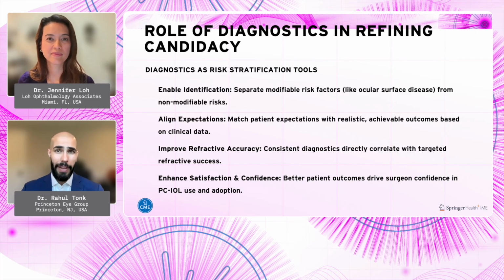And then, of course, you can get more advanced. You can do non-invasive tear breakup time, meibomian gland imaging. You can do tomography on top of topography if you have a Scheimpflug device. Certainly, you can do wavefront aberrometry. You can measure patients with various different biometers. We can get into utilization of front versus back surface measurements of the cornea with total keratometry. There's a lot of high-tech stuff that we can get into, but the reality is I think you get 80% of the effect with 20% of the work if you get a placido disc topography, OCT of the macula, and put in some fluorescein in every patient and just count their tear breakup time.